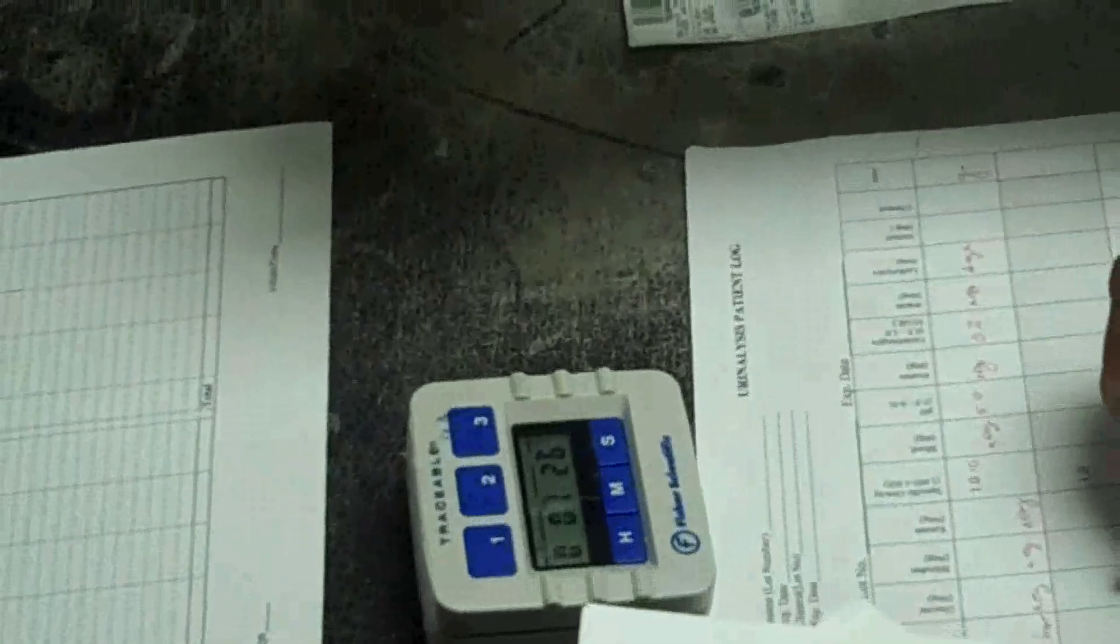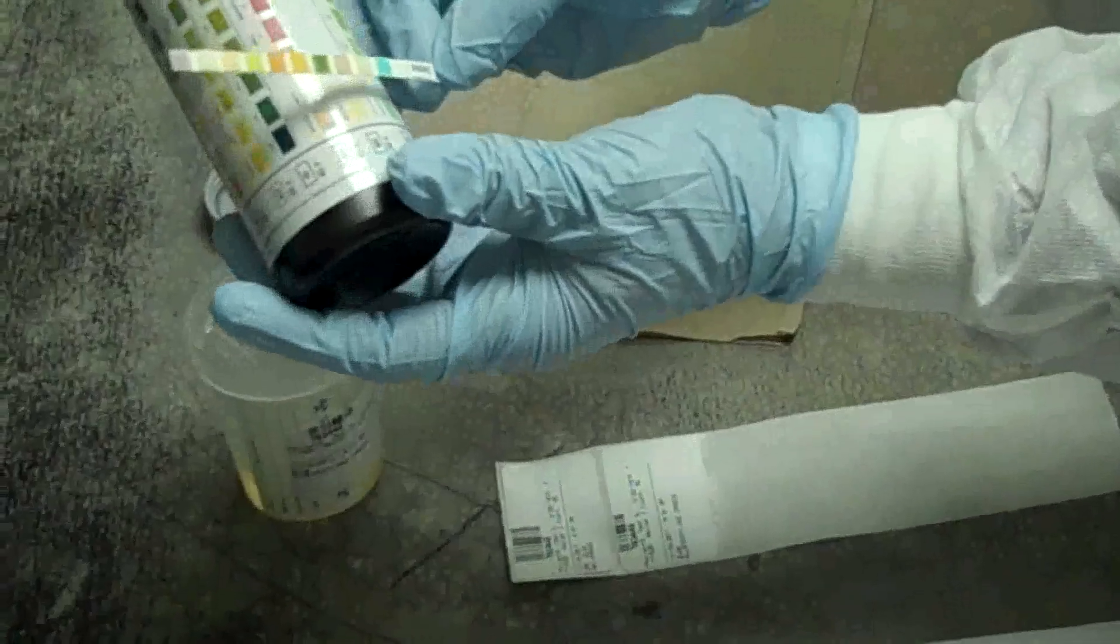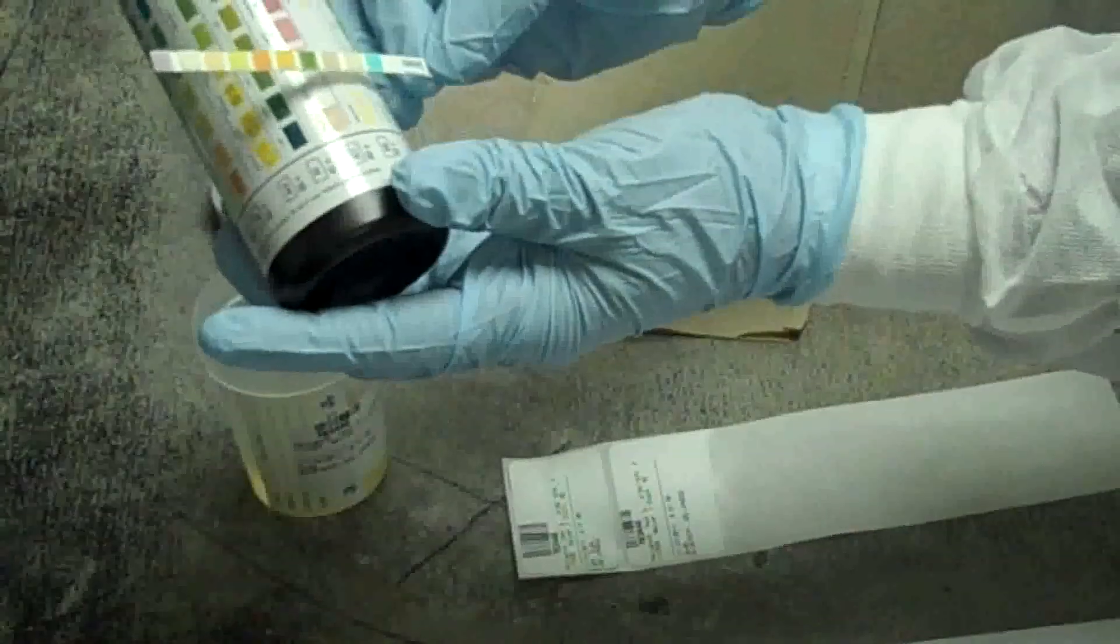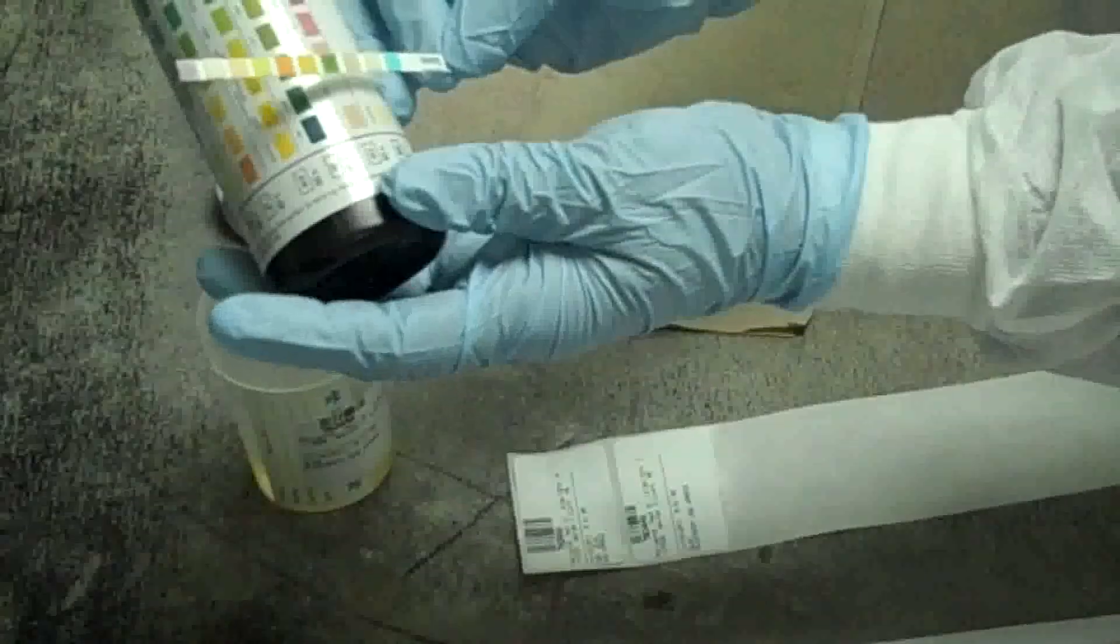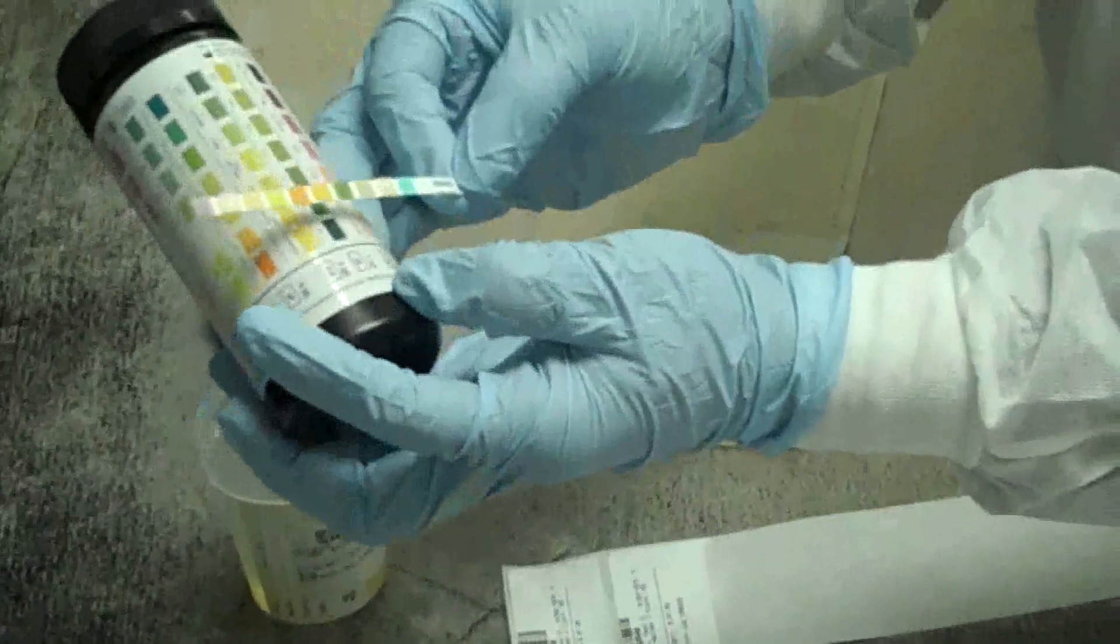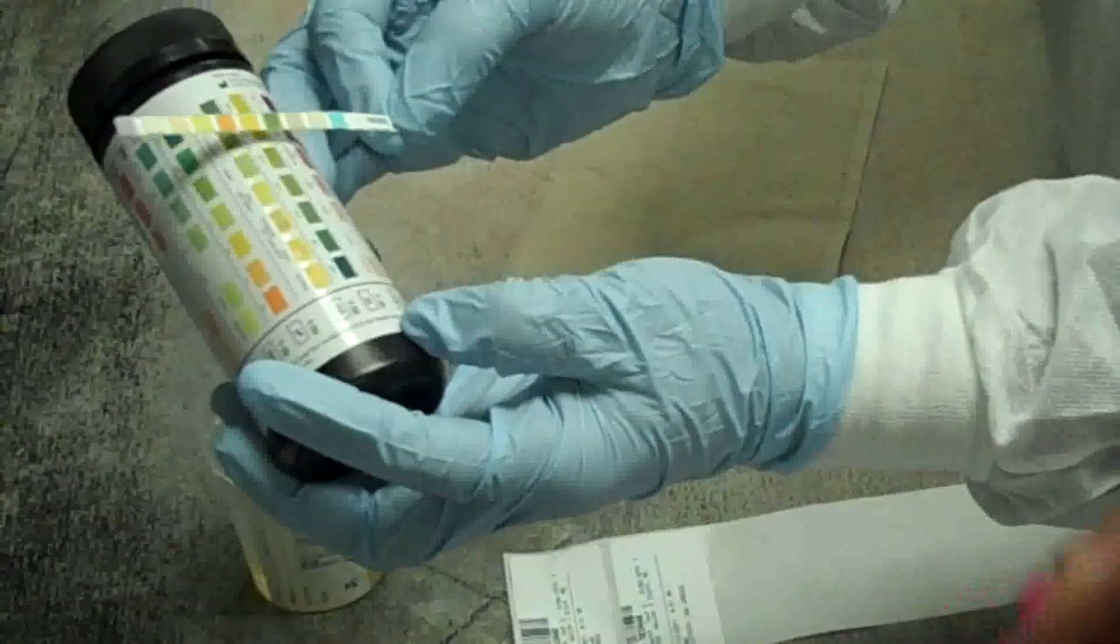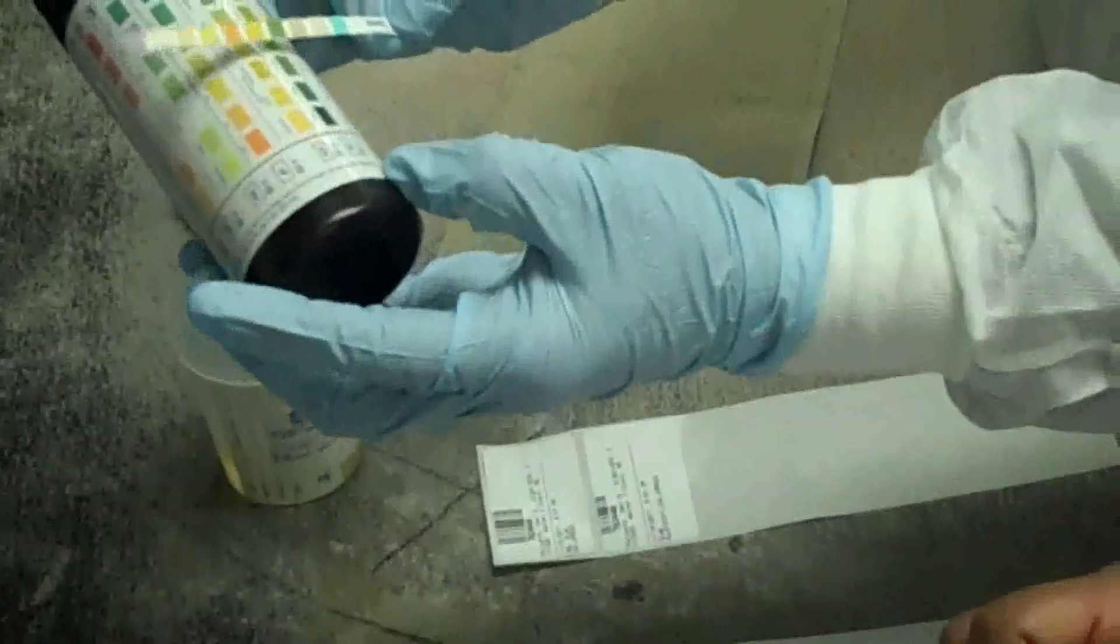At 30 seconds, we will read our glucose. Negative. Bilirubin. Negative. At 40 seconds, we will read our ketone. Negative. 45 specific gravity. 1.015.